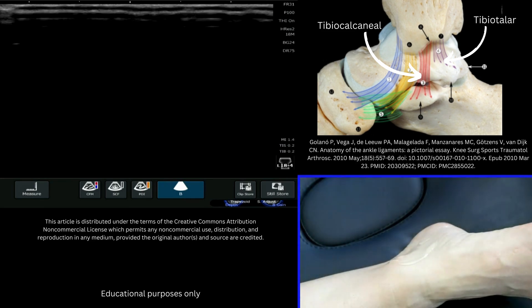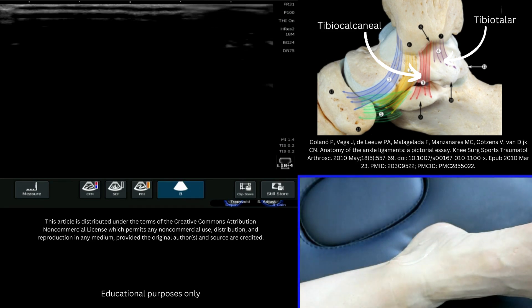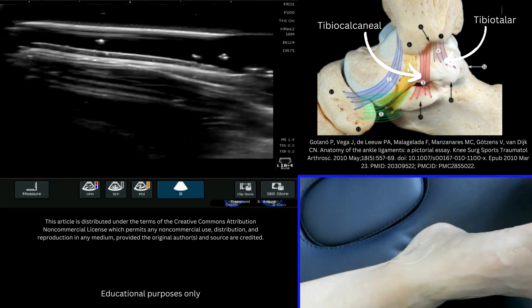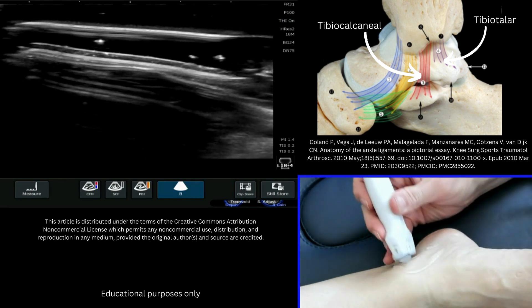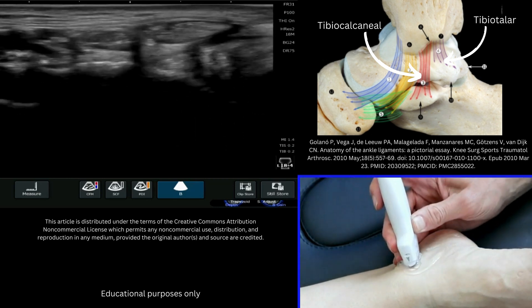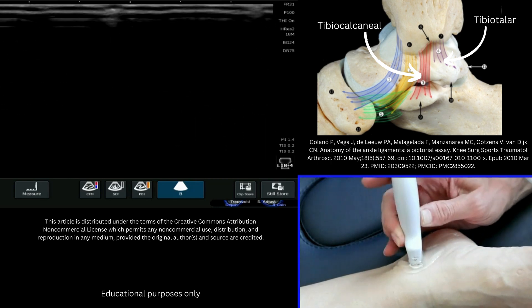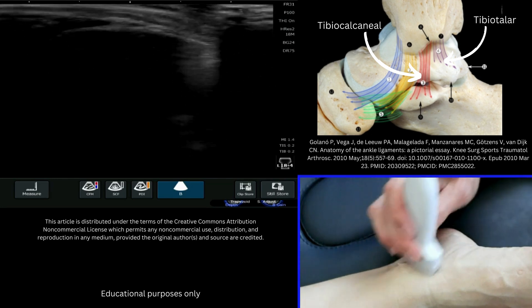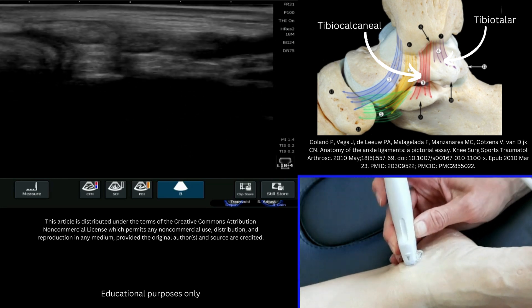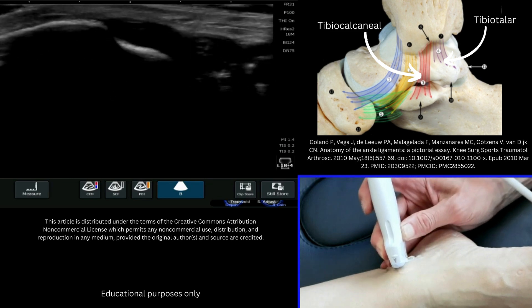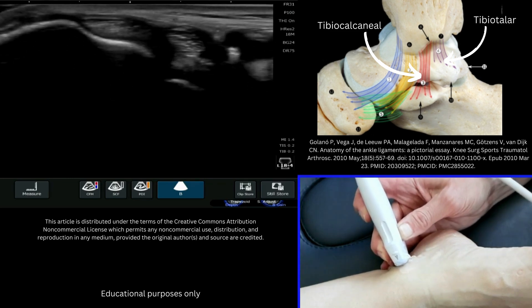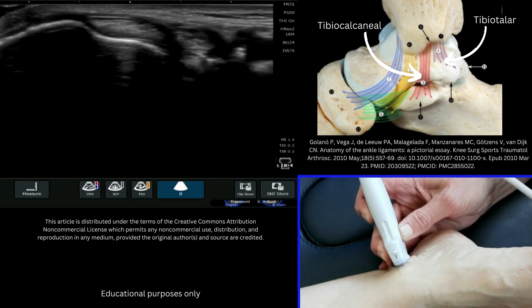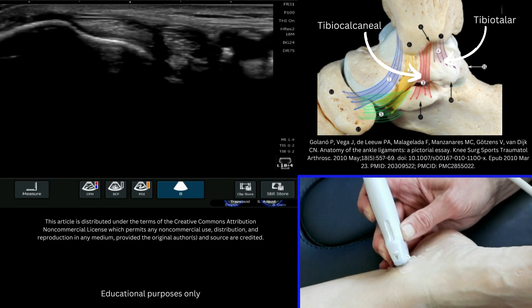When we look at this on ultrasound, it's important first of all to ensure you have plenty of gel so you can examine this region and ensure good probe contact. I'm going to put my probe on and to start with I'm going to find my medial malleolus, which is going to be on the left of the screen. Here we can see the medial malleolus with the tibialis posterior and flexor digitorum tendons adjacent to it.